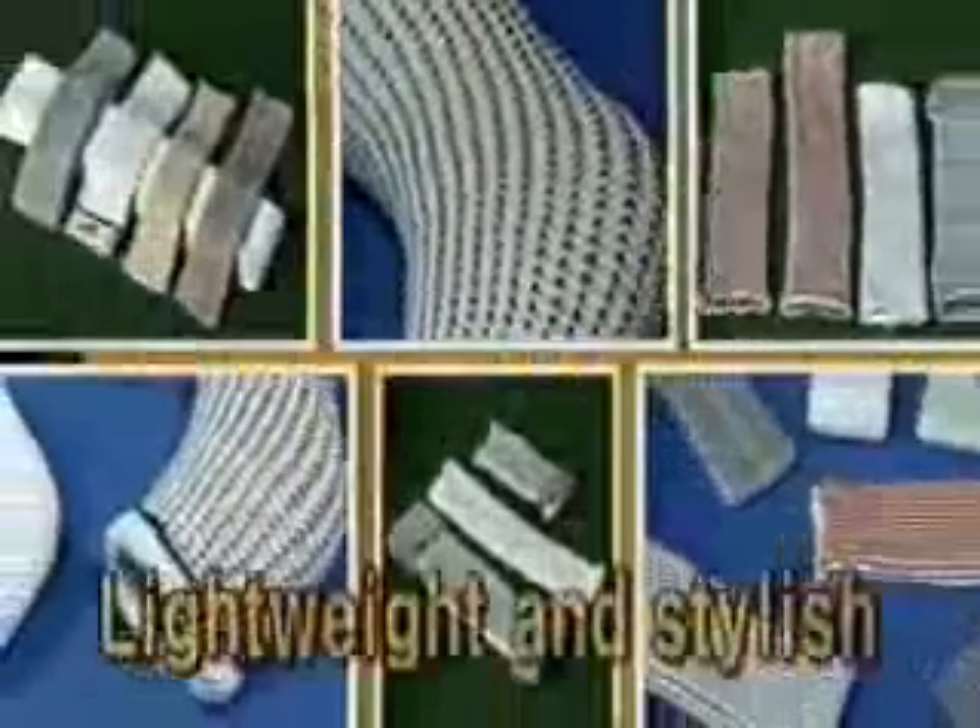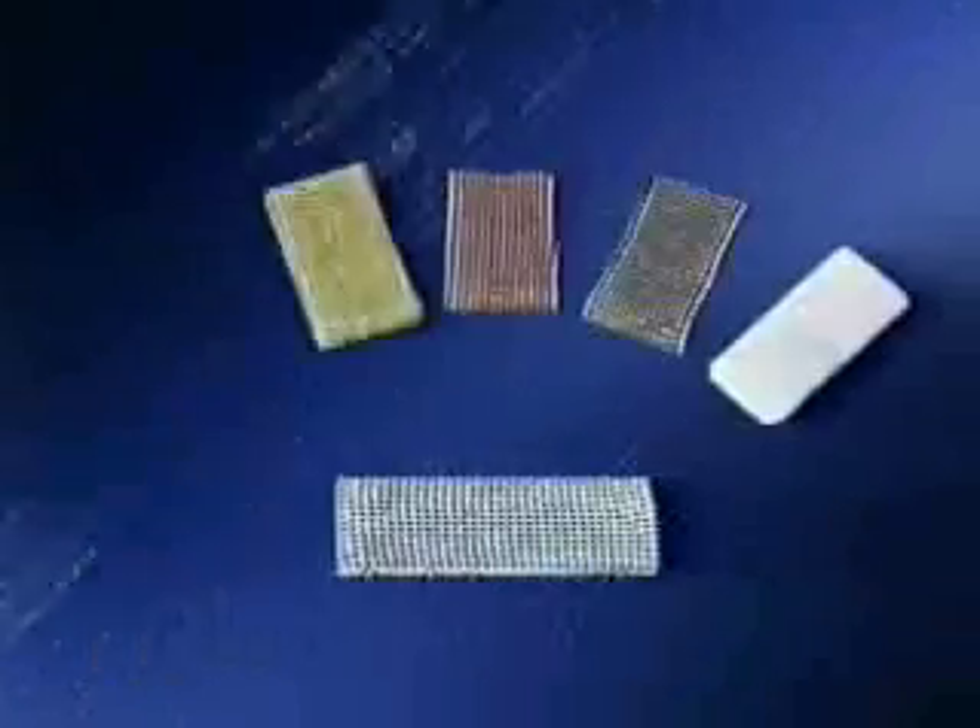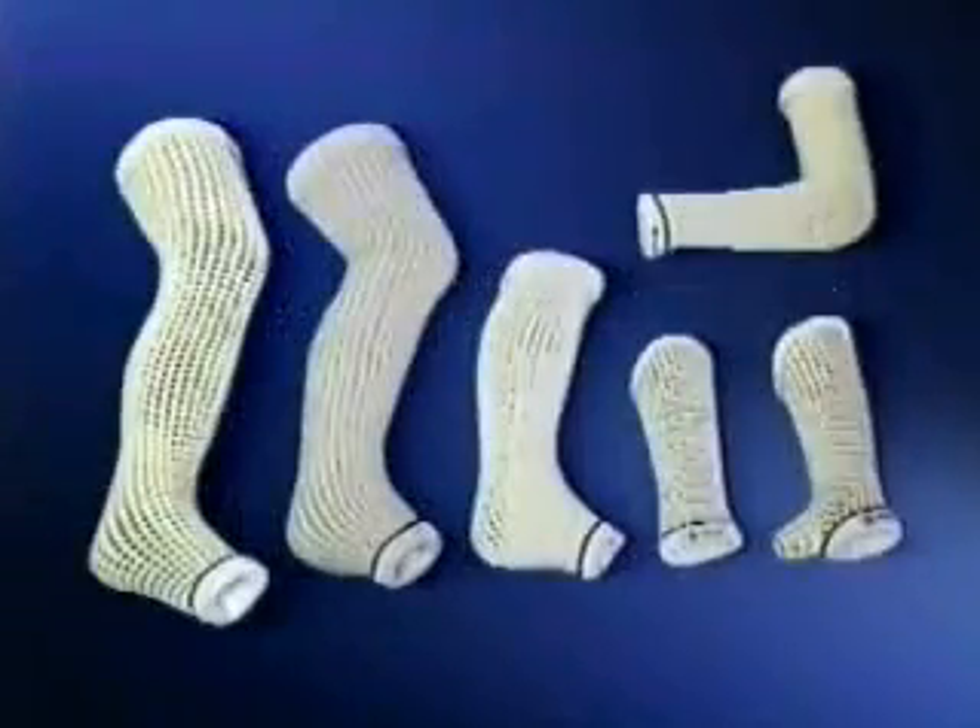This is the age of fashion, and casts should be no exception. The HM cast comes in a variety of colors and designs to fit every taste, and is made of special fabrics to be lightweight and allow for unrestricted motion.